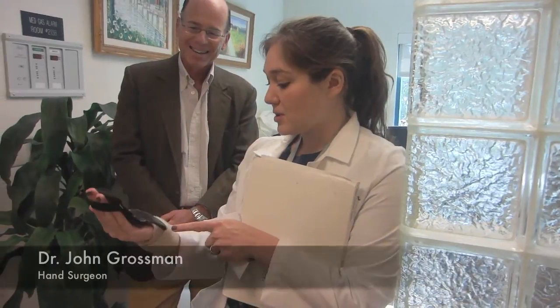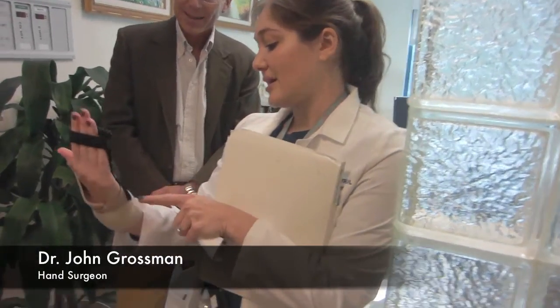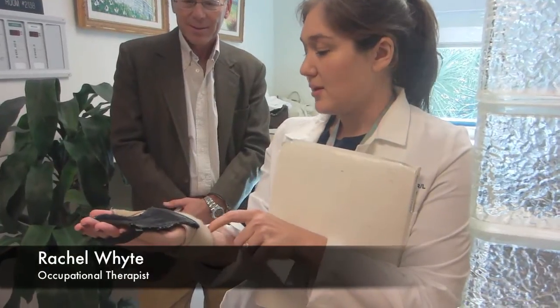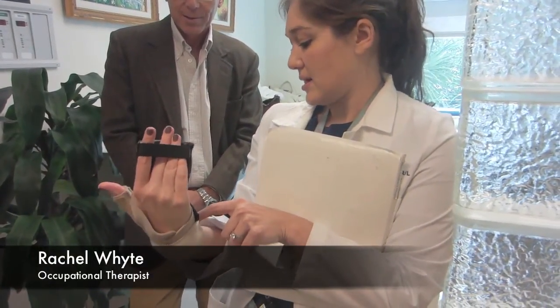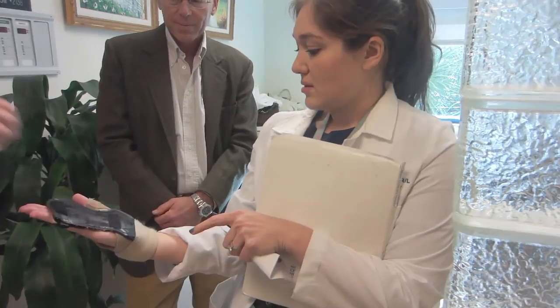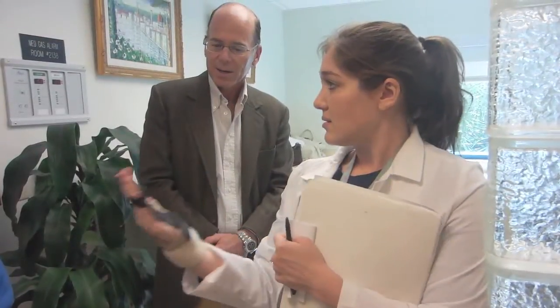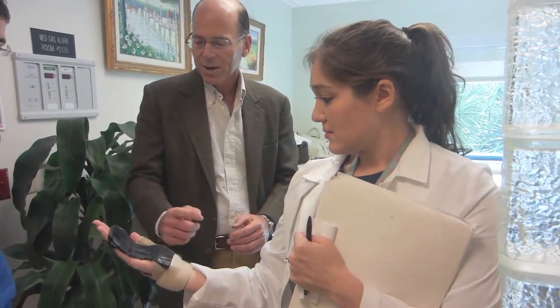After hearing Lori's opinion, the team sought out the medical expertise of Dr. John Grossman, a hand surgeon, and Rachel White, an occupational therapist. Although they liked the ergonomic design of the glove, the main concern was that a user with carpal tunnel needed more wrist stability than Prototype 3 provided. They suggested that we add pockets to the glove for removable splints to provide extra wrist stabilization, if desired by the user. They also remarked on other features of the Hold.